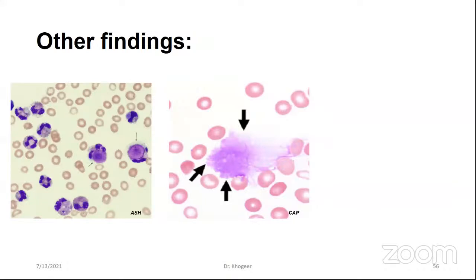So smudge cells are produced if there is heavy pressure on the spreading slide, and a pathological cause of smudge cells may be leukemia. In the lab, an albumin preparation can be used when many basket cells are present, for cellular preservation in order to identify these cells.